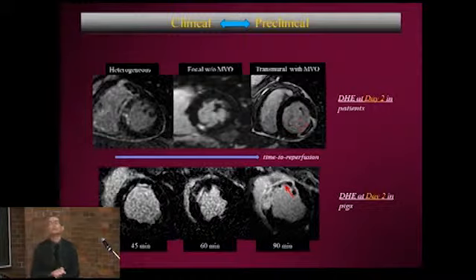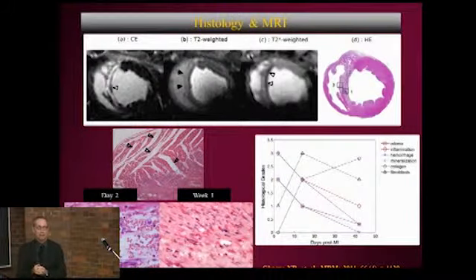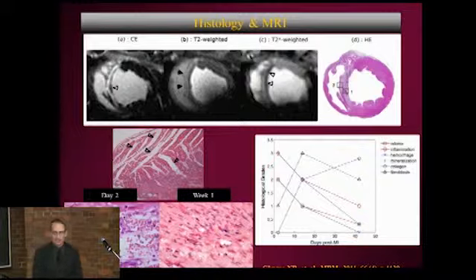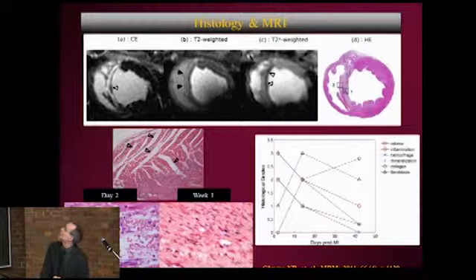So obviously the first thing we can do with a preclinical model such as a pig is get a good sense of whether those MR signals are really reflecting what I said they were reflecting. And so in this slide you can see images such as the ones I just described before, and histology. You can look at the histology and say, yeah, that's the infarct zone in an H&E stain, which corresponds really well to that region of brightness on the gadolinium enhanced image, demonstrating the viability issues.